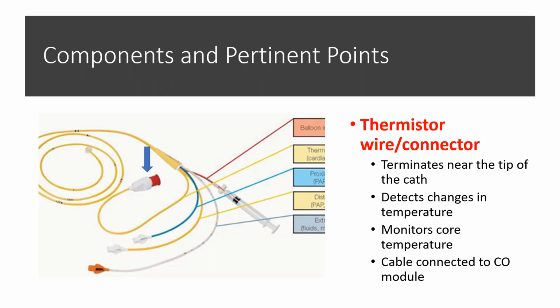How many of you have used or measured cardiac output by the thermodilution method? Anybody? Okay, so let me just discuss a little bit how we measure cardiac output by using the thermodilution method. All right, so let's see.